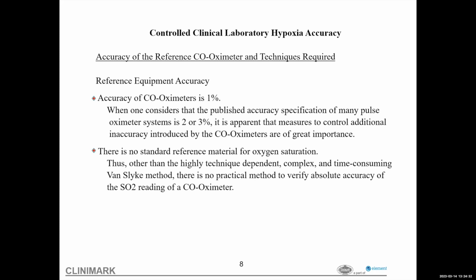So the ground truth, for example, with the Van Slyke method, is very time consuming and technique dependent, very complex. Well, that hasn't been done in any of the co-oximeters that are on the market today. They've all been reference compared to recent past co-oximeters.